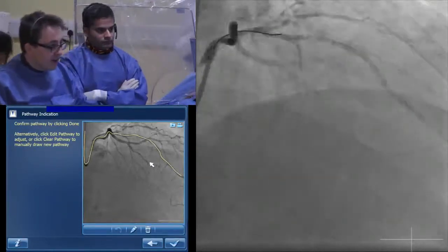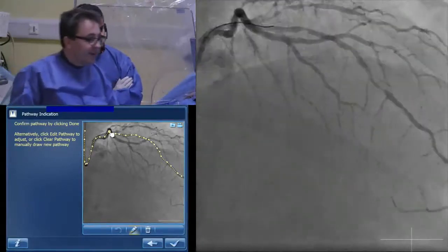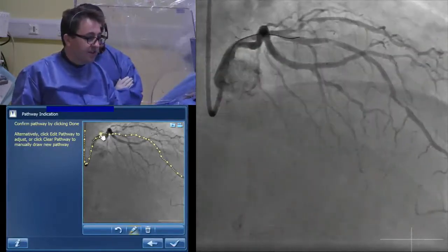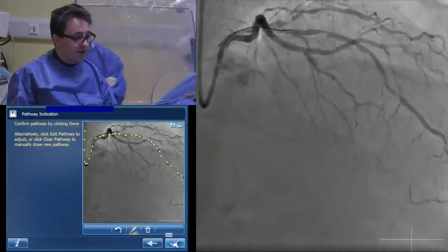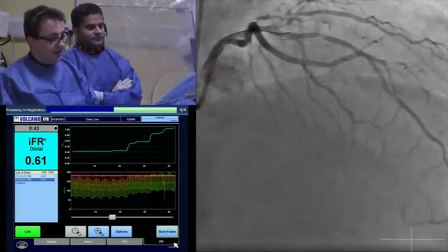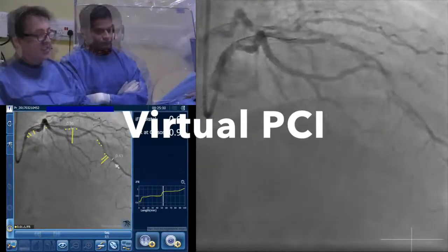I think that's broadly okay. You can see it's catching that circumflex very slightly — there's a little bit of indecision there. So I'm just going to tweak the wire position itself. That's moved up a little bit too much, I'm just going to come down with that. That looks pretty good. I'm going to go there, and we're going to do the co-registration — it takes a few seconds. There we go, so now we've got the co-registration instantly.